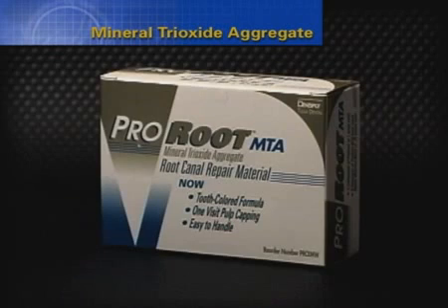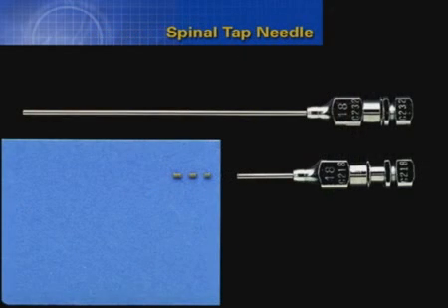As discussed earlier in the show, MTA exhibits excellent tissue biocompatibility and, when managing perforations, can be used both as a non-resorbable barrier and restorative material. As seen in the transportation section, MTA is packaged in a powder form and then mixed with sterile water to a heavy cake-like consistency. A regular length 18 or 20 gauge spinal tap needle can be appropriately shortened and utilized to carry small aliquots of various materials, including MTA.